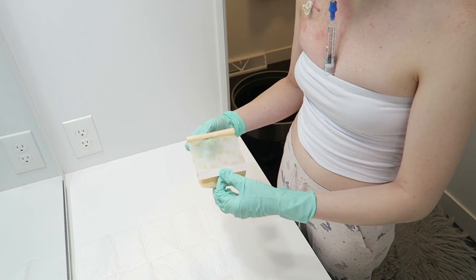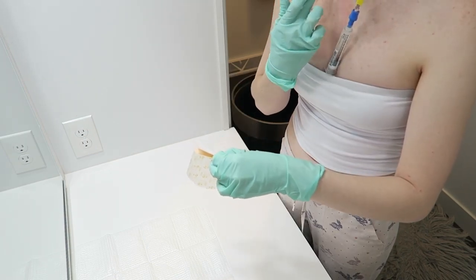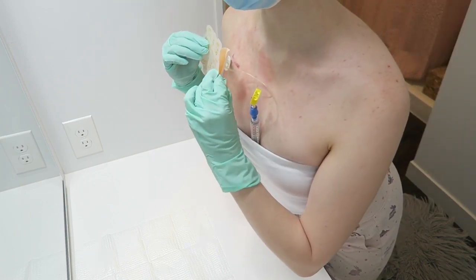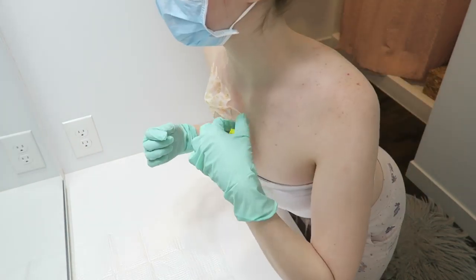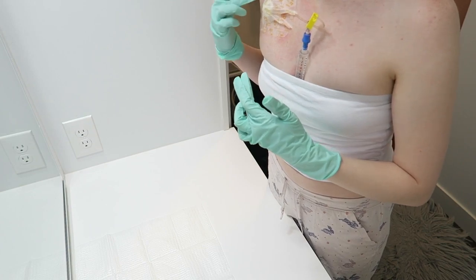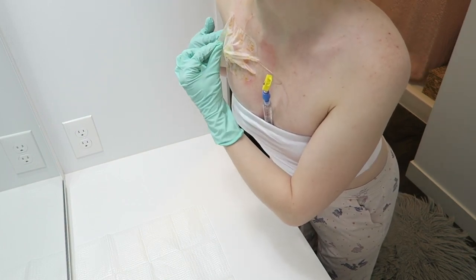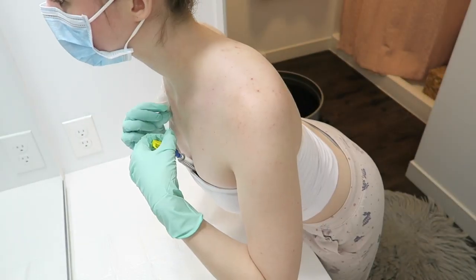So you don't want to touch the backing of the sticky part. We need to move this because we want this to be, there we go. Now we're going to put this in the middle and then kind of push it down. All right, I've pushed it down as best as I can. And with this particular dressing, there is a coating on top that you can peel back, and just the adhesive is left on your skin, or the bandage.